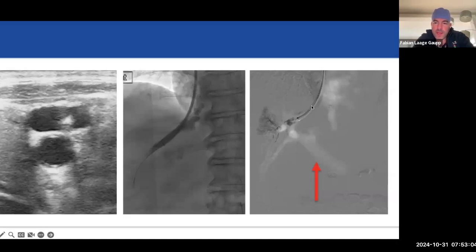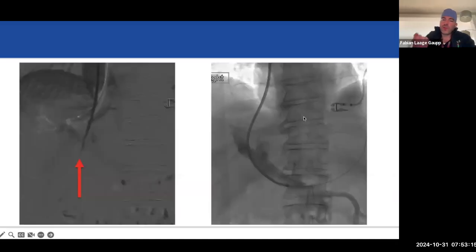All right, great. So you described, and when you do your puncture, you turn your guiding cannula anteriorly, right? So you're here in your right hepatic vein. You turn it anterior, meaning you turn it counterclockwise, right? You have it in here. You turn it counterclockwise, which is anterior, and then you do your puncture.